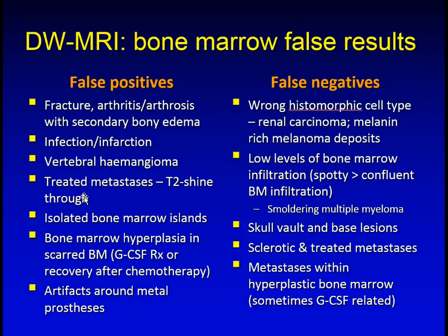So false positives and false negatives do occur. You need to be aware of those, and I've just left up a list here today just to list them for you. I'm not going to illustrate any of these in detail. These are covered in other talks that you will find on this website.